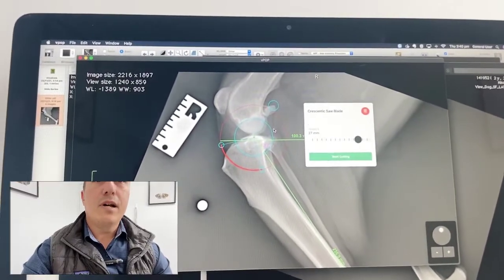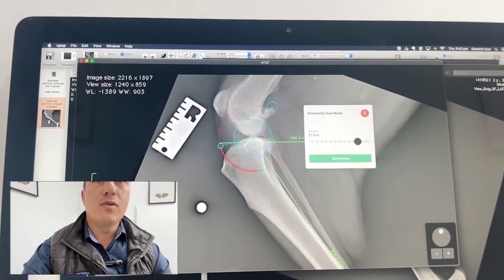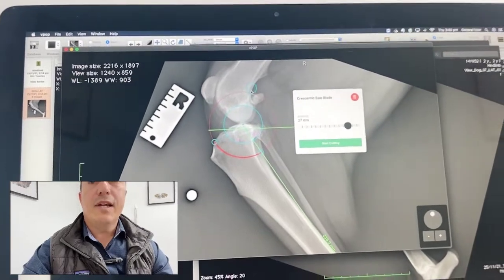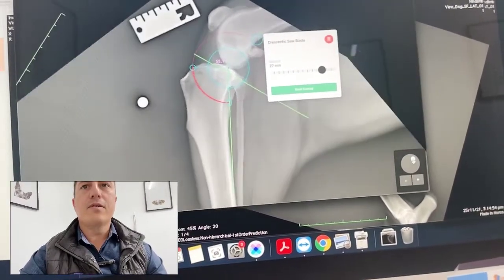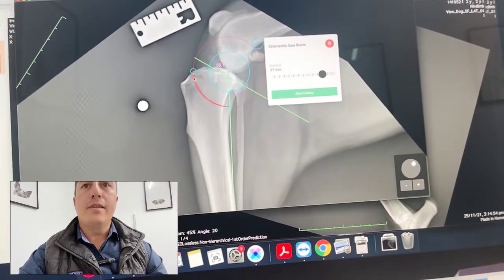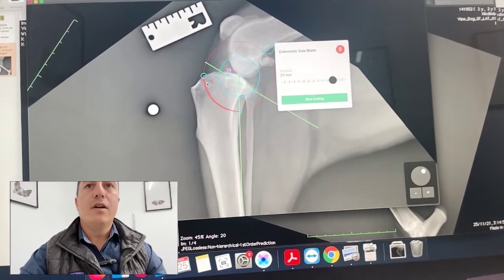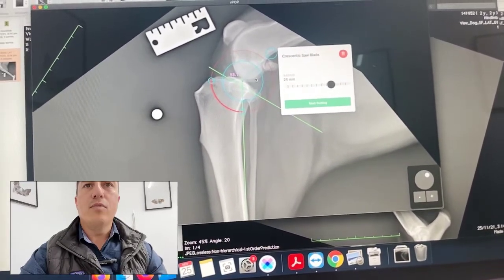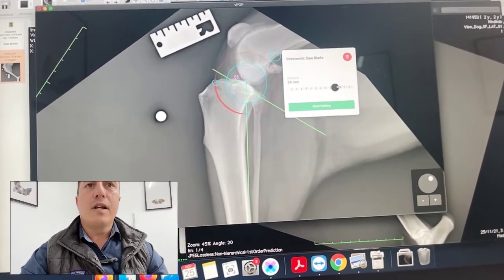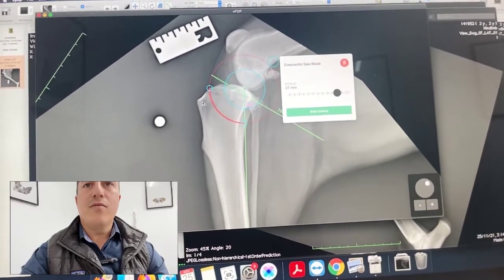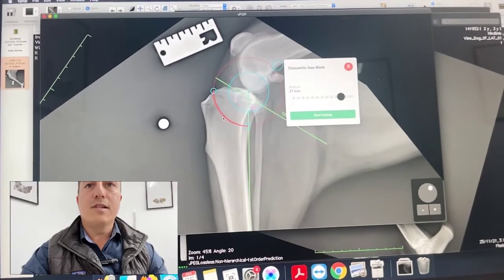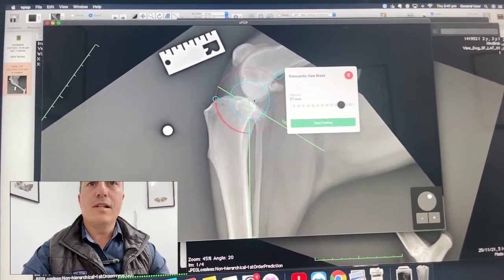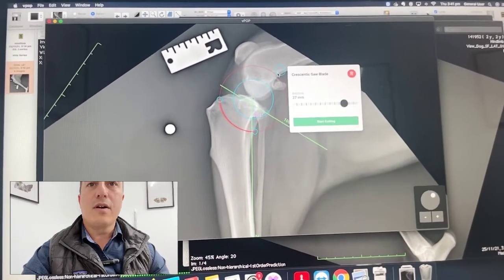So you can see that nicely there. I can get my saw and move it around, and I want the center of rotation of the saw to be pretty much on the intercondylar eminences where we were measuring our mechanical axis. We're going to look at where the saw is actually going to sit — the saw takes up 90 degrees of a 360-degree circle. I'm looking at whether we can use a 24 blade, though I might go up to a 27 blade. What I'm looking for specifically is enough width in this tibial crest, and I want the shape of the tibial crest to be a trapezoid — wider at the base than at the apex. I'm just going to move the center point a little bit more caudal and proximal to optimize exactly where it's going to go.